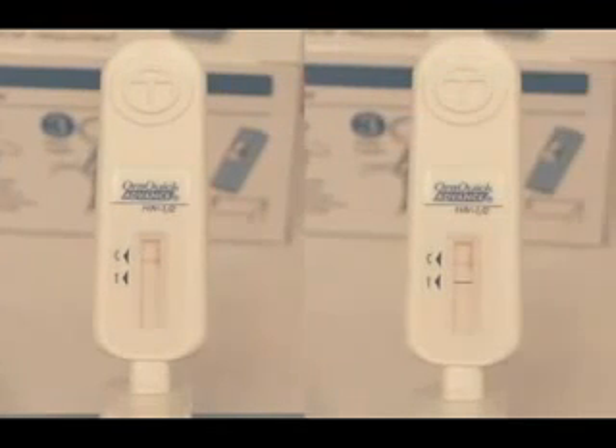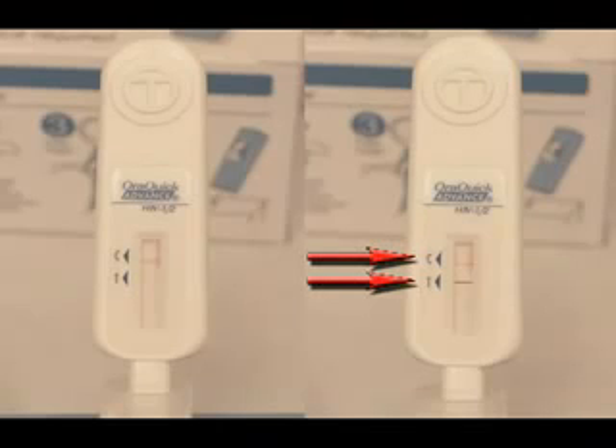A test is reactive if a reddish-purple line appears next to the triangle labeled C, and a reddish-purple line also appears next to the triangle labeled T. However, one of these lines may be darker than the other. The test is reactive if any reddish-purple line appears next to the T triangle and next to the C triangle, no matter how faint these lines are. A reactive test result means that HIV-1 and/or HIV-2 antibodies have been detected in the specimen. The test result is interpreted as preliminary positive for HIV-1 and/or 2 antibodies.